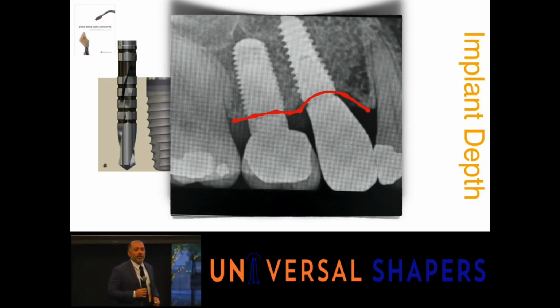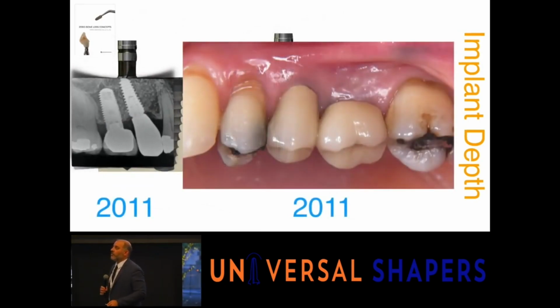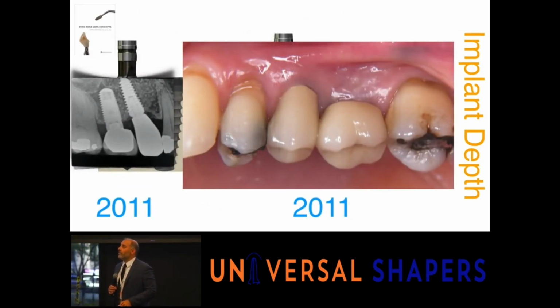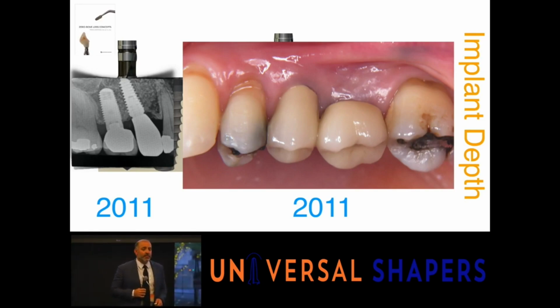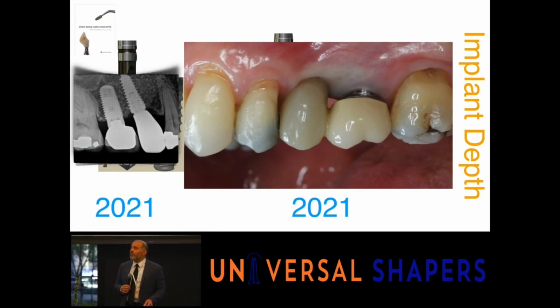But let's take a look at it on day of 2011. They look pretty good. This crown's looking very nice. All right, that corresponds to the posterior implant here. And this crown over here is looking very nice. Even with the lack of emergence profiling that we did on that, it still looks very nice. Let's see how it stands up over time. With the depth of the implant placement on this tooth, we get the same amount of bone loss, looks exactly the same, but look at the soft tissue and look what happens to it.